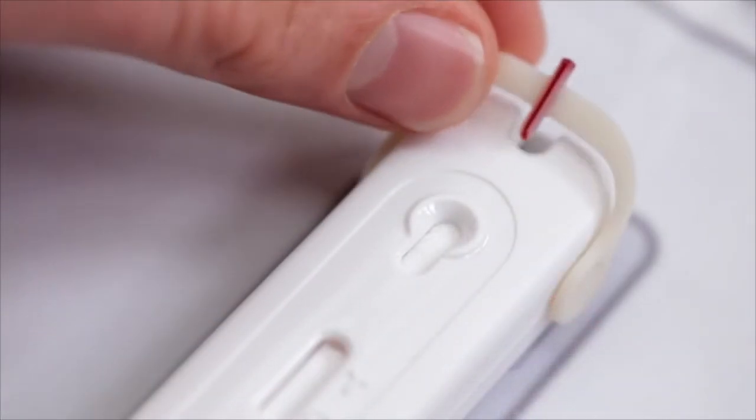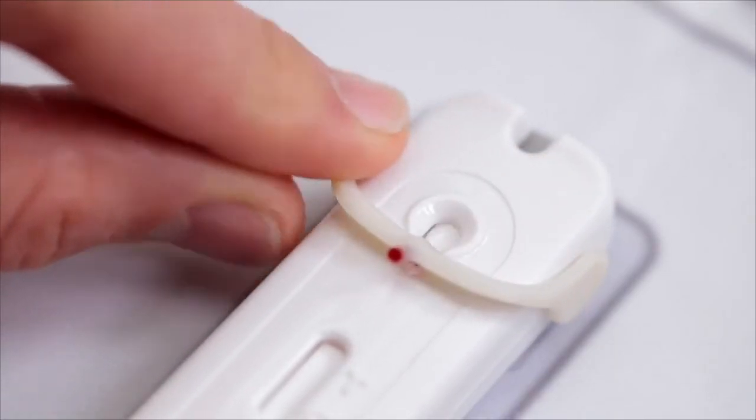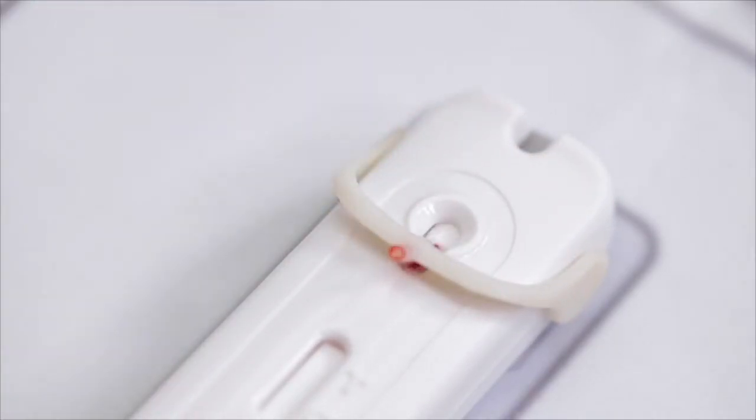Hold the test on the table and flip the tube over using its support arm until it stops. Check to make sure the blood has moved from the tube into the well.